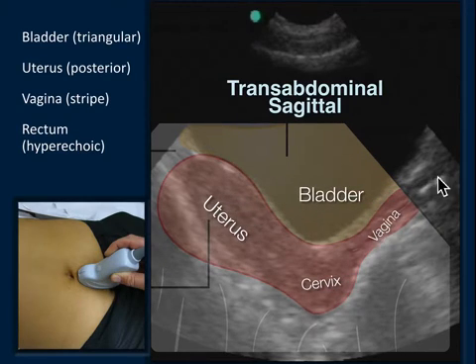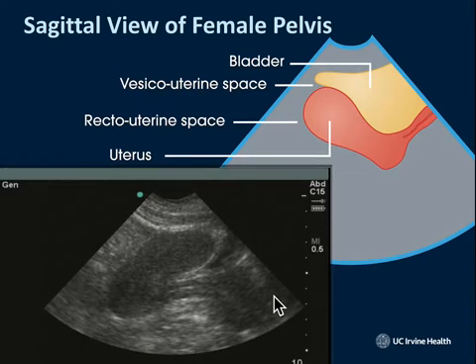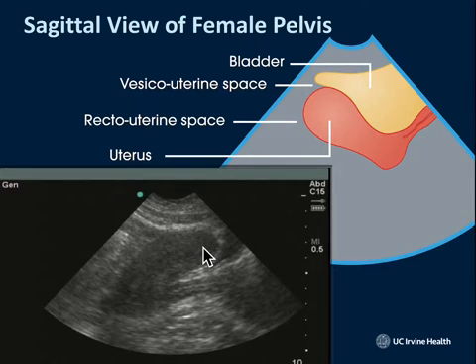The vaginal stripe is this hyperechoic line here that terminates at the cervix, and then the anteverted uterus comes up this way. Anterior cul-de-sac, posterior cul-de-sac back here. Good. So this is what it looks like when you have a really empty bladder. The bladder is actually over here, hard to see because it's so empty. Vaginal stripe, cervix, and then the uterus wraps 180 degrees back towards itself there. And when the video clip plays, I think you get a sense of that very anteverted uterus.